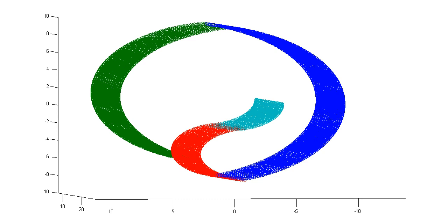So there's this many-way control where we know that, to some extent, neural activity is correlated with blood oxygenation level, and blood oxygenation level is correlated with fMRI in a strong enough way that you can confirm relatively robust features of the brain that have been characterized by other methods. That gives you a strong baseline that yes, the fMRI is telling you something that is seemingly quite real about basic features of neural activity.